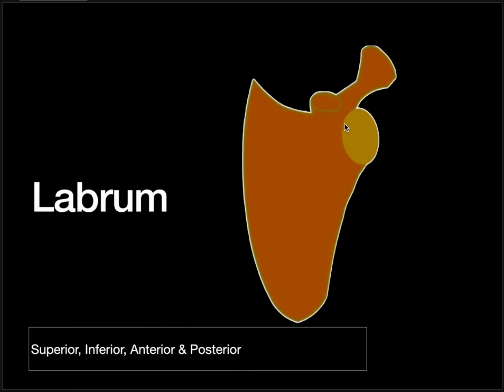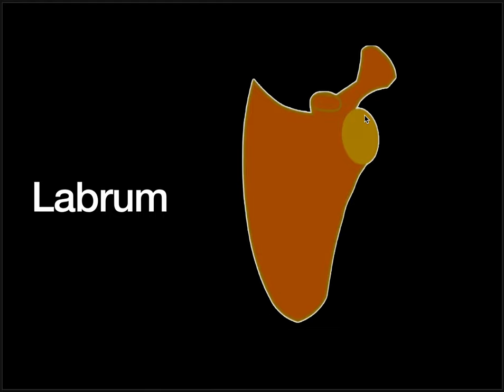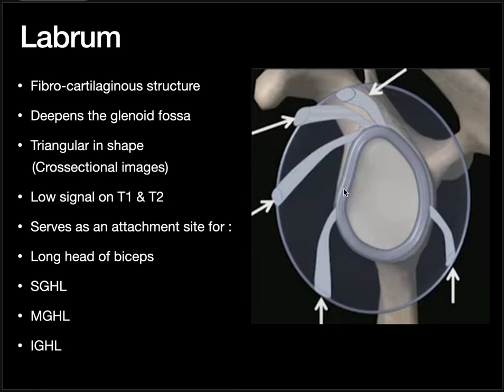Next, coming to the labrum. The glenoid cavity is a very flat structure, but it has to articulate the humeral head, and so to facilitate this, we have a labrum. The main function of the labrum is that it deepens the glenoid cavity so we can better articulate the humeral head within it. The labrum is a fibrocartilaginous structure that deepens the glenoid fossa. It also has attachment for the long head of the biceps on the superior labrum. The superior glenohumeral ligament, middle glenohumeral ligament, and inferior glenohumeral ligament also attach to the labrum.